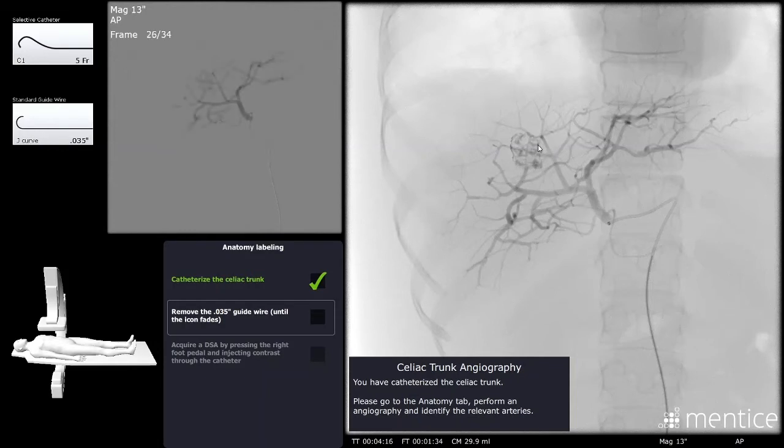and that's the lesion that we would like to treat. From here, depending on if you had come from radial, the catheter will be coming down and scooping in like that, or obviously from the femoral it comes up and goes this way. What we are looking for here from the vascular anatomy is to try and find out which arterial branch or branches supply this lesion, because that's what we want to treat.